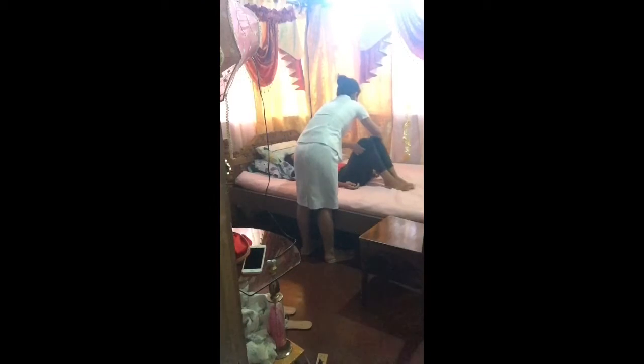Position the equipment appropriately. Imuhang ipaubos ang bed, and then imuhang ilock ang imuhang bed. And then i-place the imuhang wheelchair parallel sa ato ang higdaanan. Assist the client to a sitting position on the side of the bed.